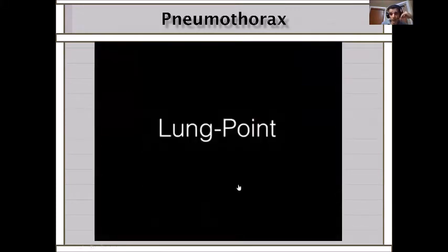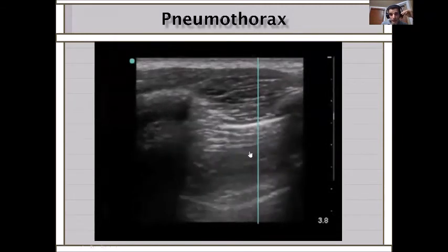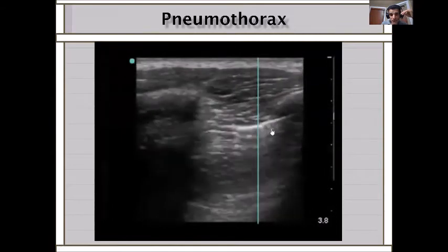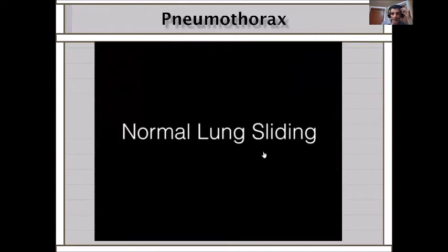And look at the lung point, more clear. Look at this B line, this one. Do you guys see it? Yes. Now, do you see this B line? Yes. Do you see this one also? You see it, it's sliding. See it, moving. Okay? So there are B lines in here and they stop in here. It does not move, does not finish. They call it lung point. This is where the pneumothorax ends. We'll go more. Again, we'll repeat this again.